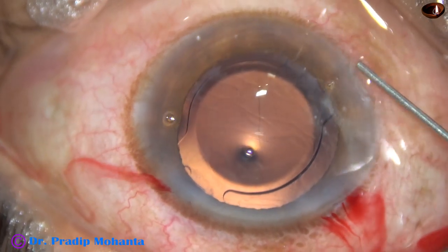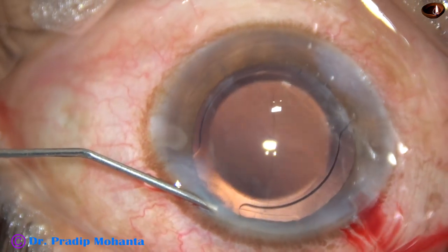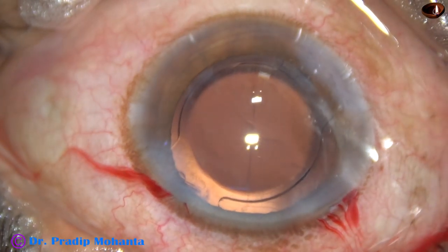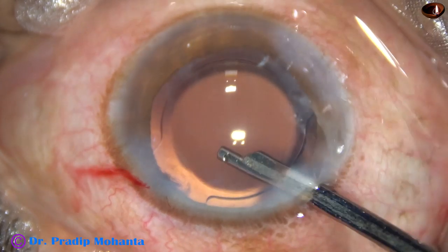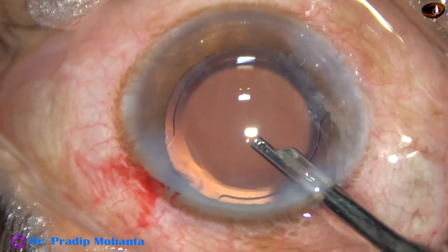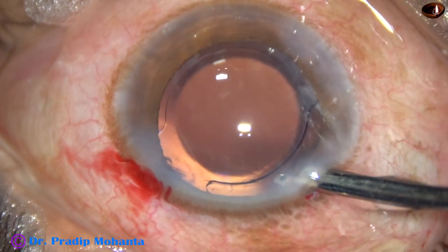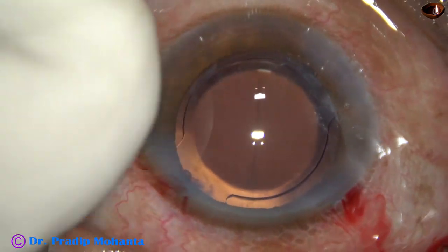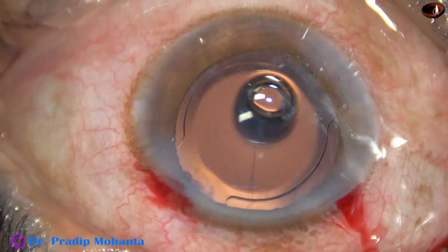Now the side ports are to be closed. Corneal stroma on either side of the ports is hydrated and the ports are closed. This is the final lavage of the anterior chamber — it is nicely irrigated with BSS and the anterior chamber is formed.